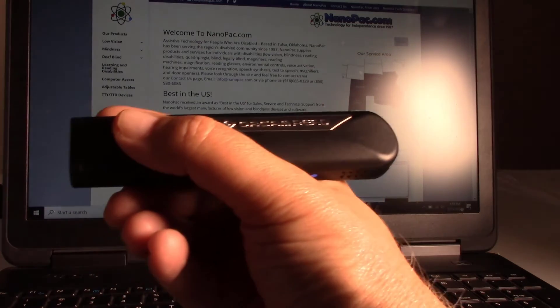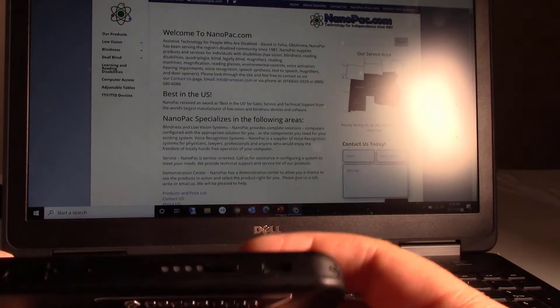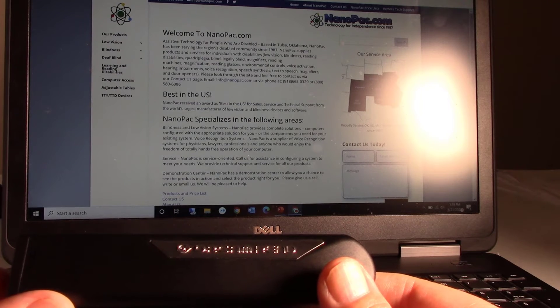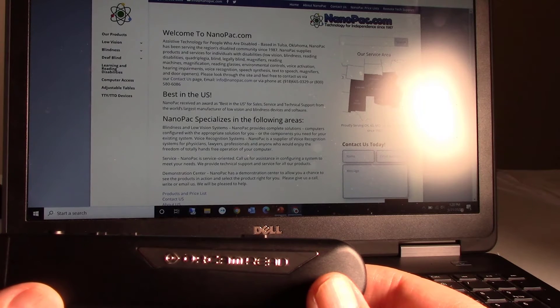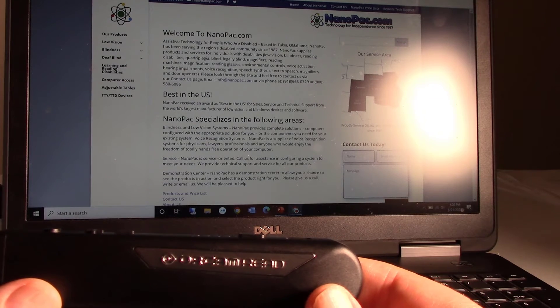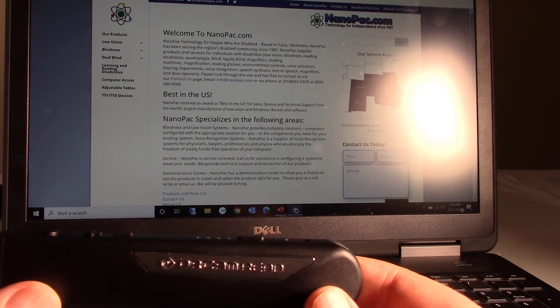OrCam Read. I'm going to put it in standby. The device says: 'Suspending. Press again to shut down.' So I could press it again and it would shut down, but it will go into standby — 'Suspended.' If you don't press any buttons, it will automatically go into standby in three minutes, and after three hours it will automatically turn itself off.